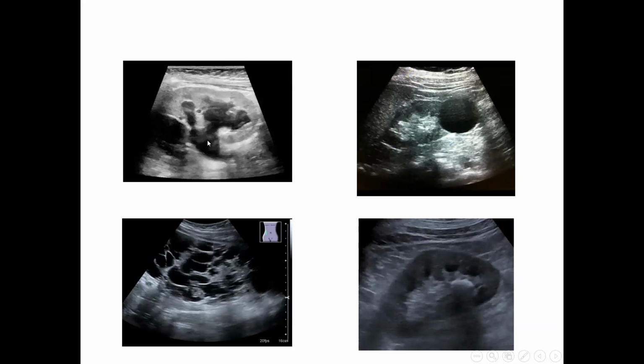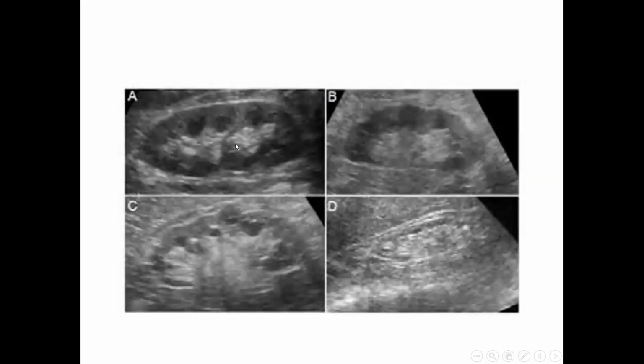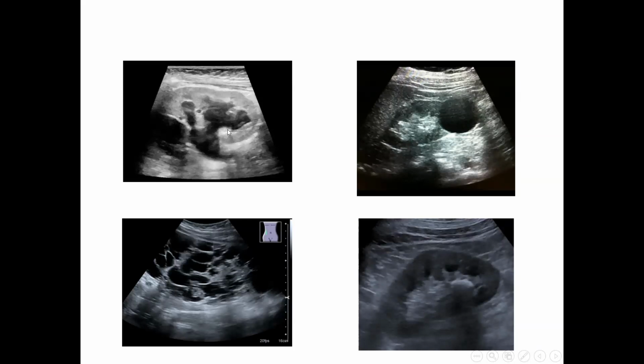You don't see this in a normal kidney. There's no hydronephrosis. So why would you see a dilated collecting system in a normal kidney unless there is obstruction? So this is hydronephrosis. What is this? Cyst, right? It is a round structure, and you see the sound waves are easily passing through it because of the fluid inside. Fluid, remember, in ultrasound is always jet black. Okay, fluid is always black. So the sound waves easily pass through. That is why you have posterior enhancement here.